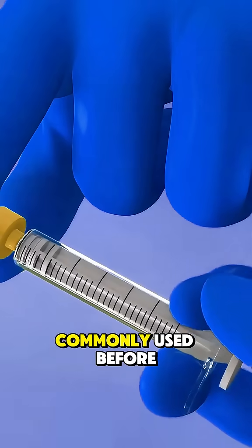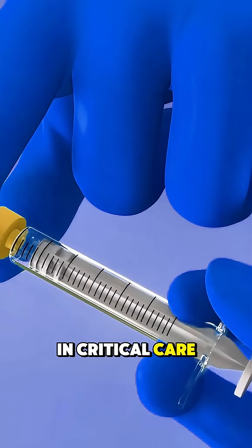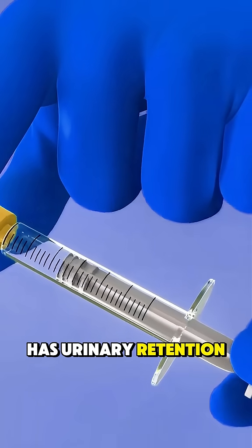Foley catheters are commonly used before surgeries, in critical care, or when someone has urinary retention.